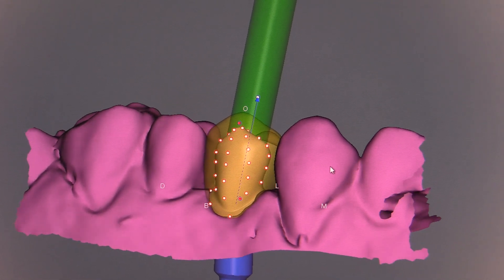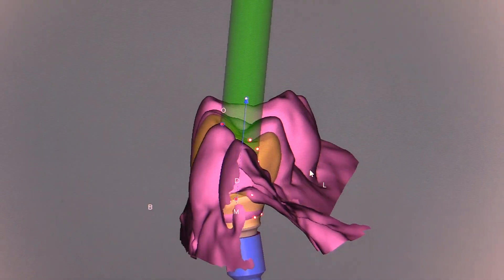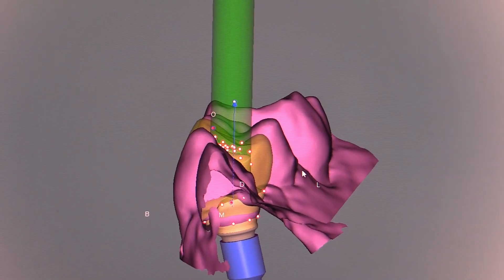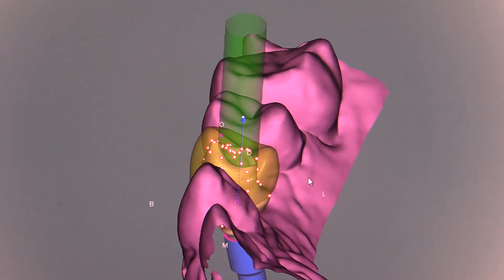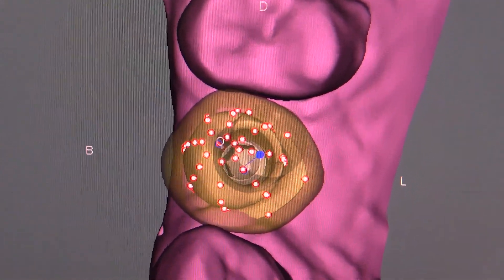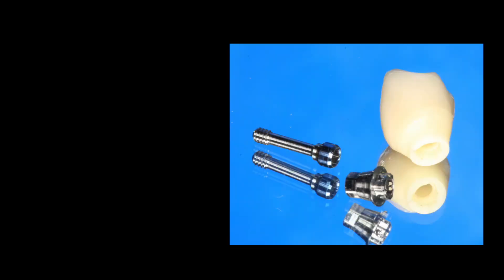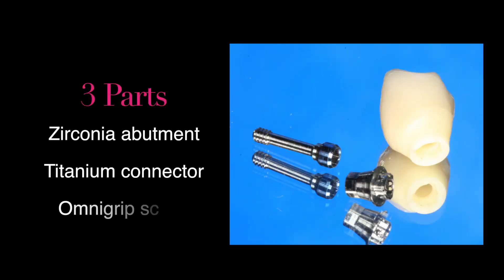As we rotate this abutment around, you'll see little handles — dots — and you can pull on these dots to cause the thickness of the zirconia to be added to or taken away. Ultimately, we want the channel to be right in the central fossa area. There are three parts that are going to be put together: the zirconia abutment, the titanium connector, and the OmniGrip screw.